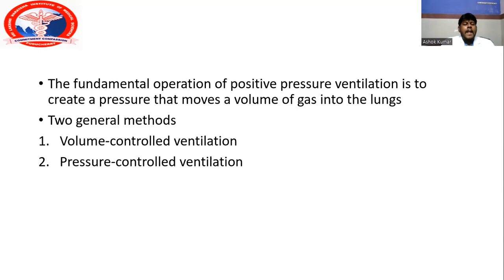And finally, we proceed to the main system of mechanical ventilation theory part. The fundamental operations for positive pressure ventilation. Define positive pressure ventilation. Anyone in the class, please tell me what is positive pressure ventilation.